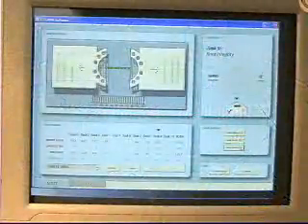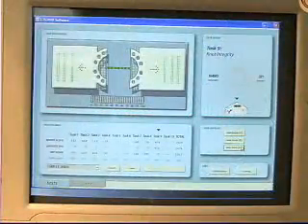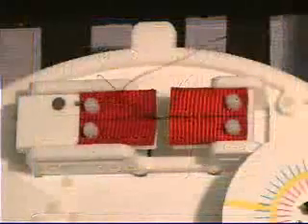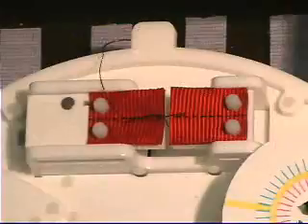50 penalty points are assigned for a suture placed outside of the pre-marked area. A cutoff time of 480 seconds is assigned for this task. A score of 0 is assigned if the knot slips or fails the tensometer test, as shown here.